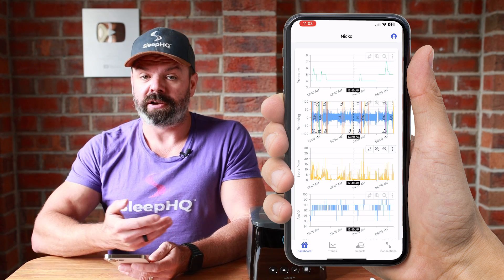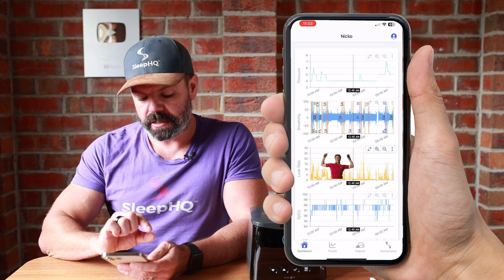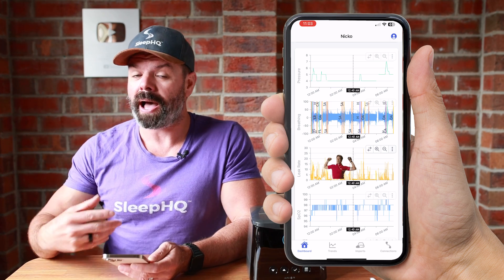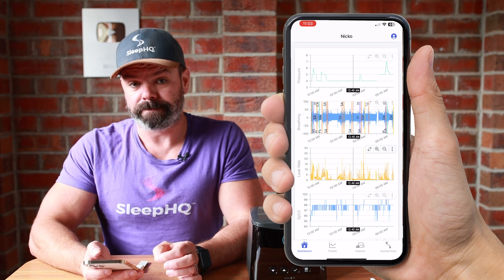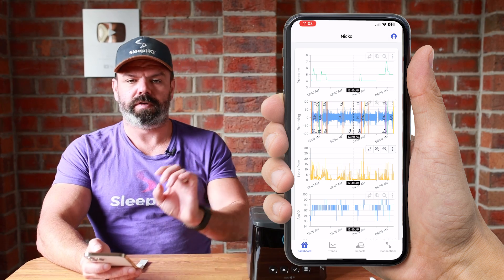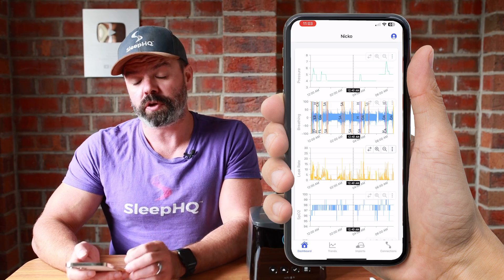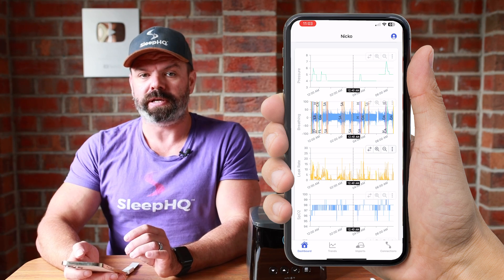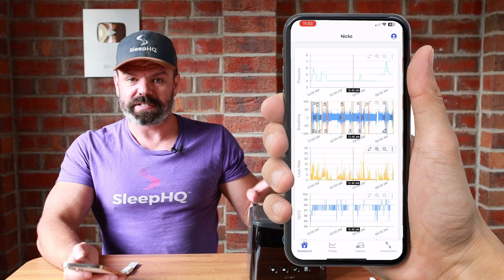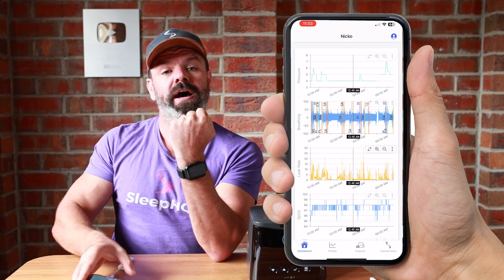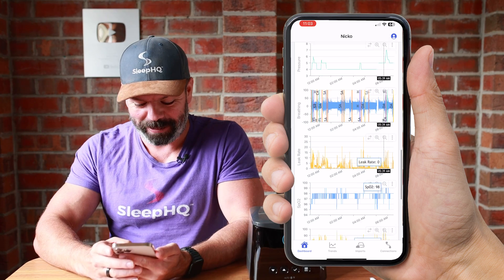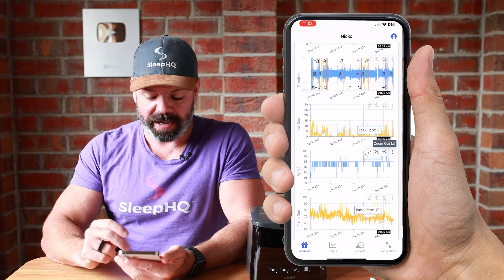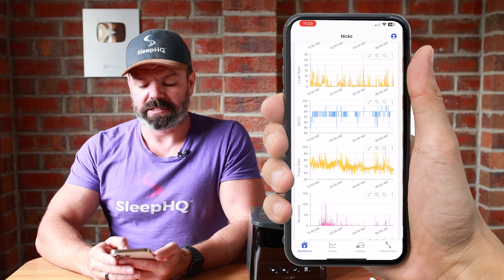After resetting the charts, we also have all our leak rate data, which is really important to see periods throughout the night where your mask is leaking, or perhaps your mouth is leaking. You can also see on this example we've got blood oxygen — SpO2. This isn't coming from the CPAP device; it's coming from a SleepHQ O2 ring. The beauty of SleepHQ is you can combine pulse oximeters, CPAP data, Apple Health data, sleep stage data from an Apple Watch, and a ring. We've also got pulse rate data and movement data throughout the night in bed.